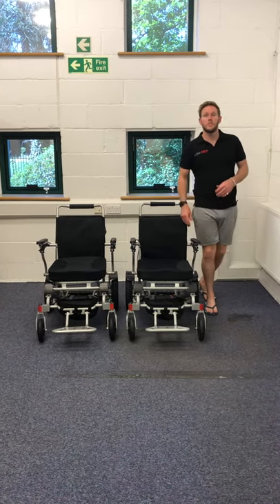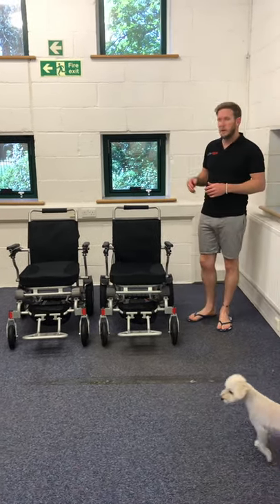Hi, this is Tomy from Liftec Mobility. In today's video we're going to be talking about our very latest chairs.